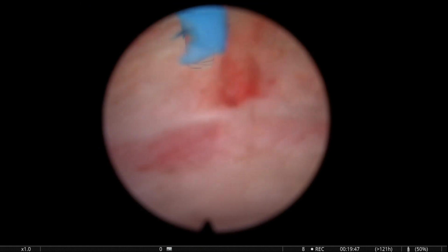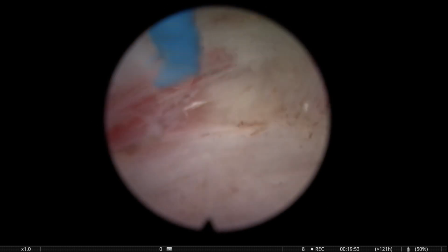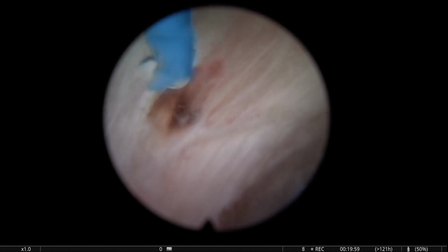And then it is paramount to work slowly. You see that the movement of my scope is like in slow motion. It's always calm and relaxed.